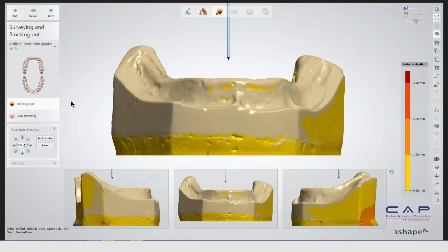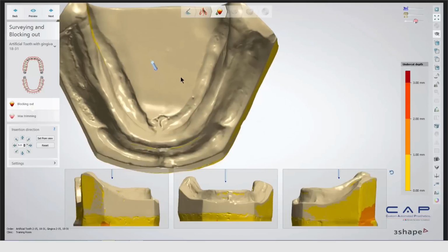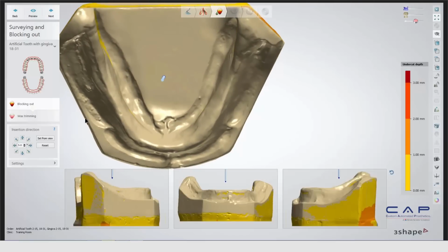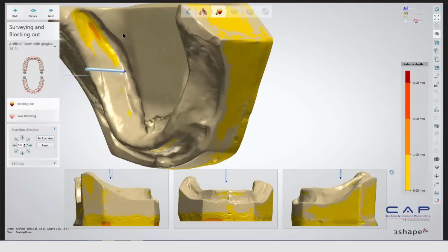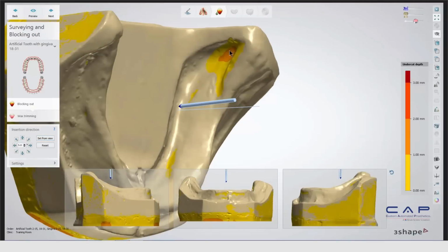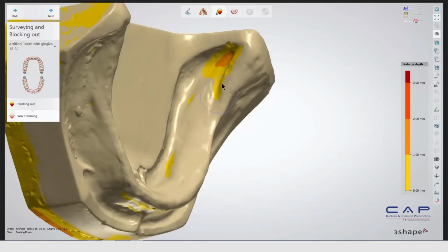Next, we're going to do the same thing, but this one's going to be for the lower. So we're going to look at it like this, straight on, and then hit Set from View. Now with this one, we will have undercuts on these areas here, which we see in orange. So we do want to block out those ones, but we want to be careful not to go too far to the edge.